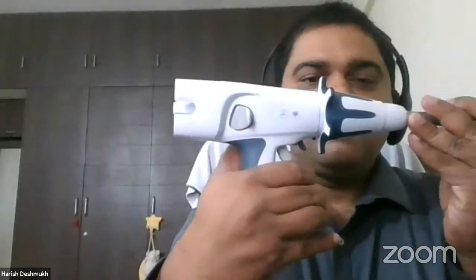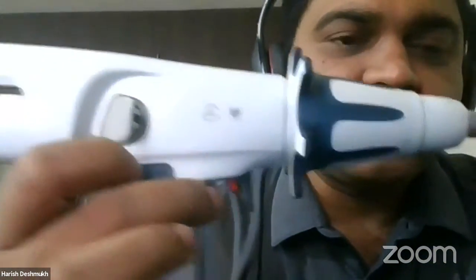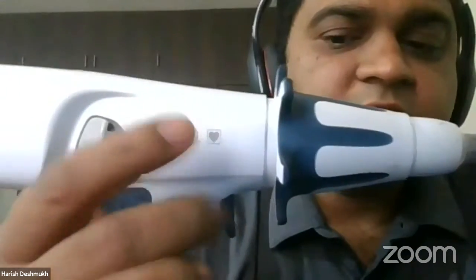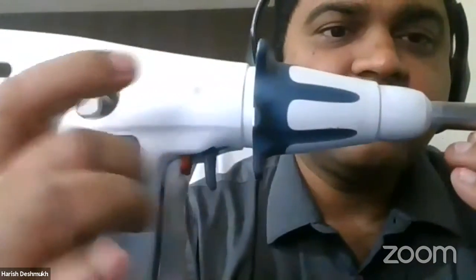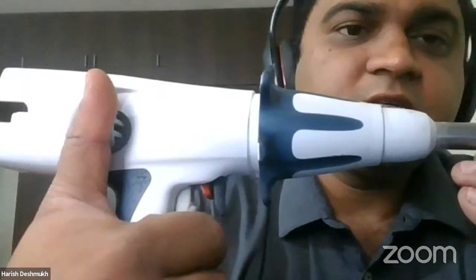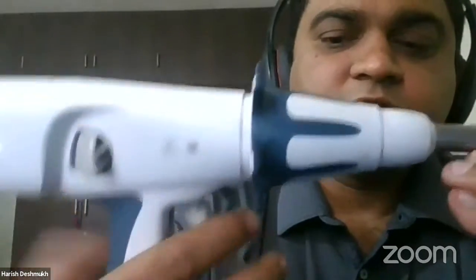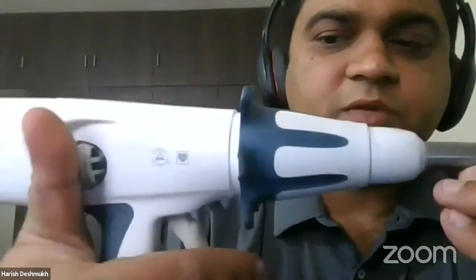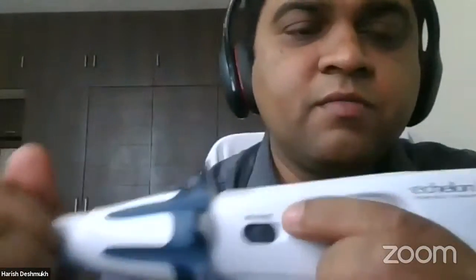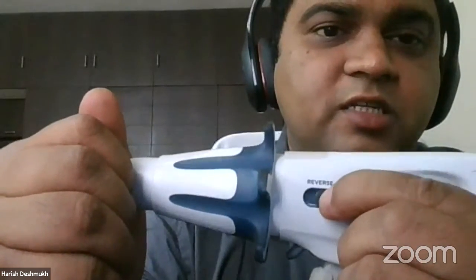Then we have a safety lock. You can see a green safety lock and a red safety lock here. Then we have a firing trigger, which is gray. Onto this you can see the release button, so you have to open it up. This is for the closing trigger, and this is for the release button. In case of misfire or any troubleshooting, we have a reverse button as well. So this is a powered platform.